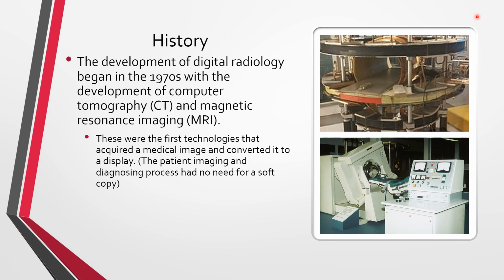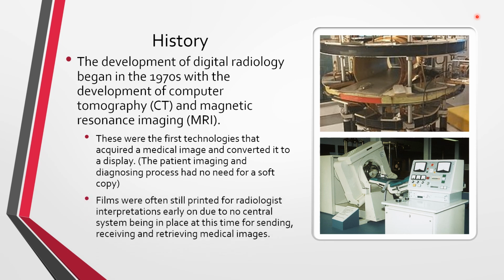These were the first technologies that acquired a medical image and converted it to a display. Therefore, the patient imaging and diagnosing processes had no need for a soft copy. There was no need to have a film in the acquiring of the image and the diagnosing of the patient from the image. Films were often still printed for radiologist interpretation early on due to no central system being in place at this time for sending, receiving, and retrieving the medical images.